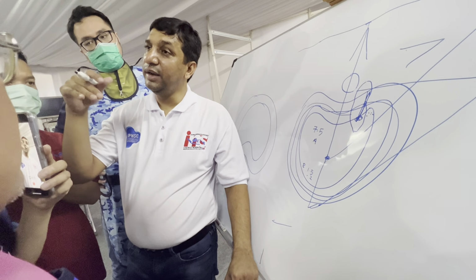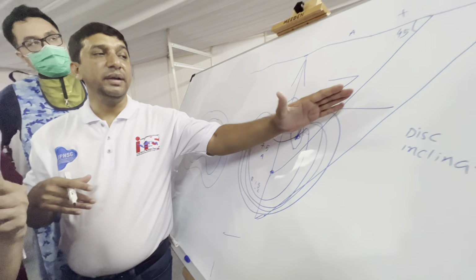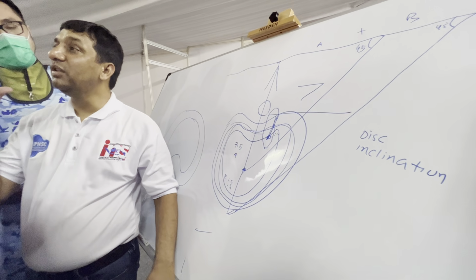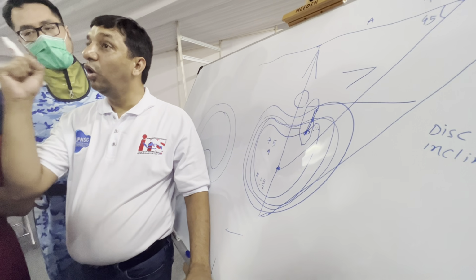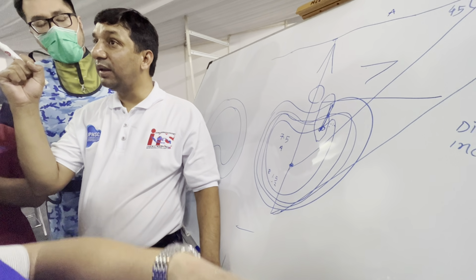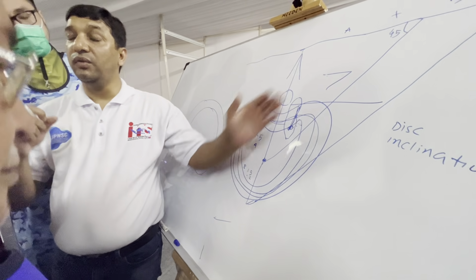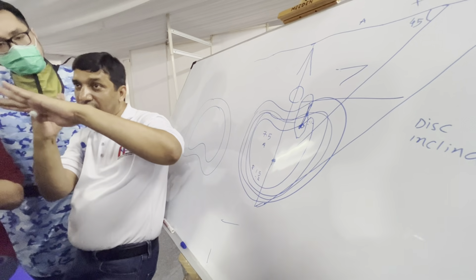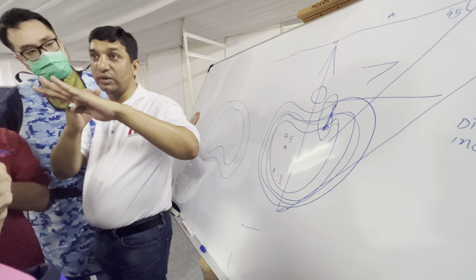You go with a certain degree of angle. What are the advantages? Once you go through the annulus, the annulus acts as an anchor. It will hold your cannula, so the cannula is fixed. The second is the facet. You can use the facet as a lever, so if I am going like this, I can use the facet as a lever to see more dorsally also.